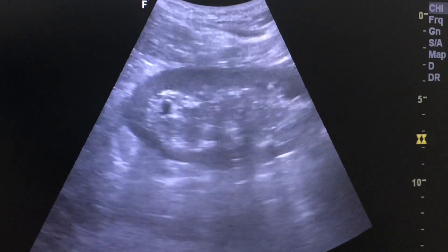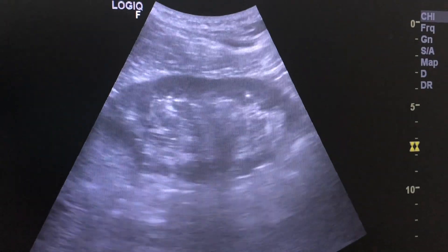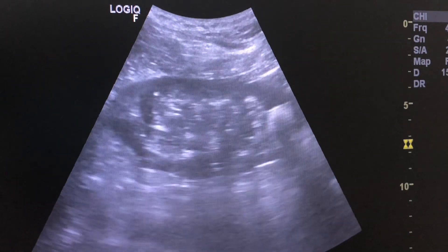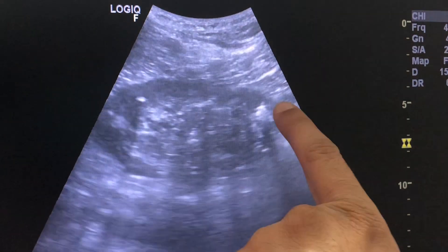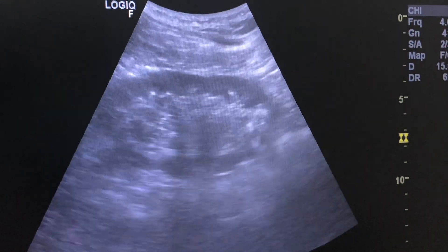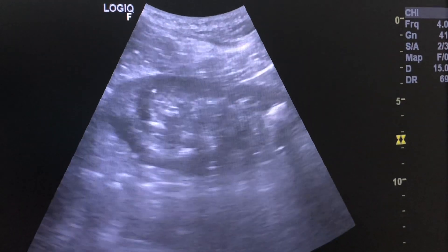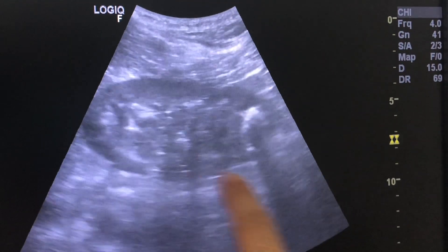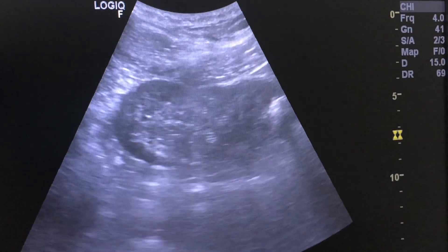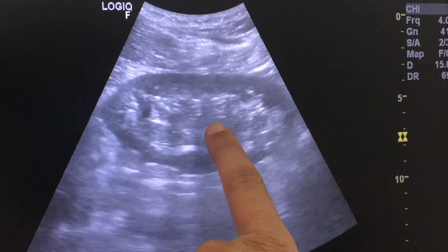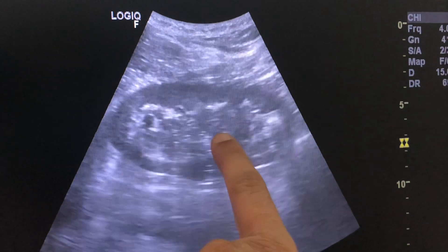60-year-old male patient complaining of pain in the left loin region. This is the lower pole calculus. This is the left kidney showing thinning of cortex with loss of corticomedullary differentiation.